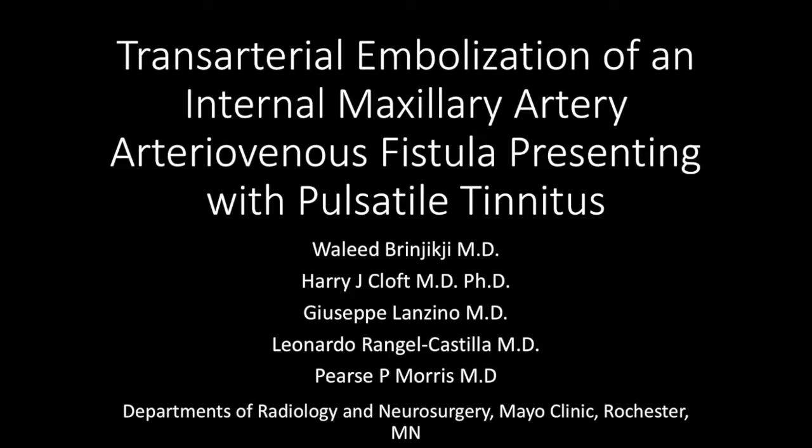Hello, my name is Walid Brinjikji, and I'm going to be presenting a case of transarterial embolization of an internal maxillary artery arteriovenous fistula in a patient presenting with pulsatile tinnitus.